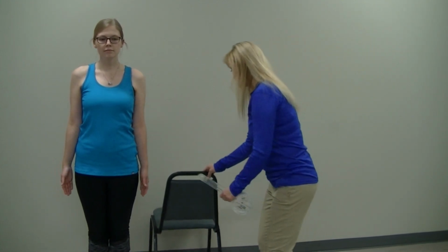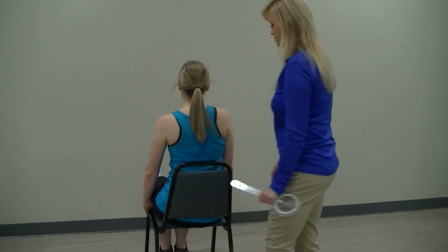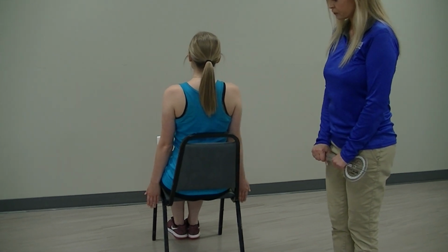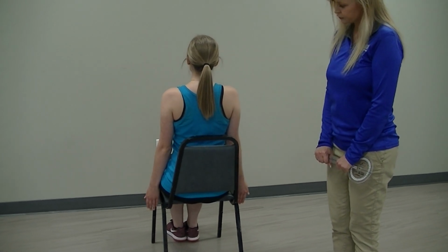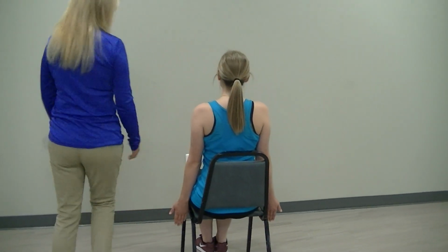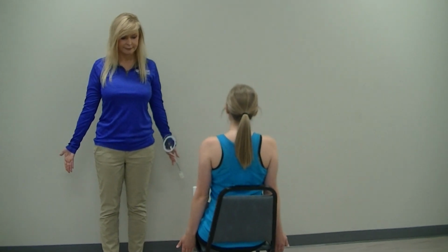When measuring in a seated position, the client is sitting in a chair with their feet on the floor and back supported. Ideally, the chair would be free from armrests, as this can interfere with the performance of the motion and the measurement. The arm is in the anatomical position with the shoulder adducted down to the side, the elbow is in full extension, and the forearm is in supination.